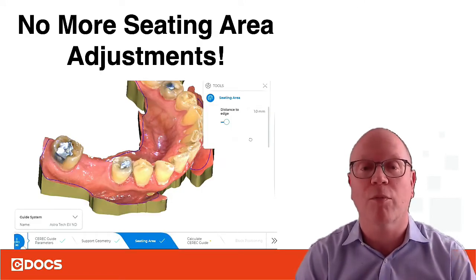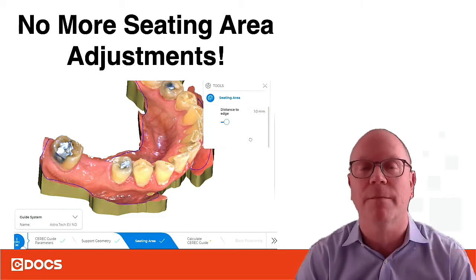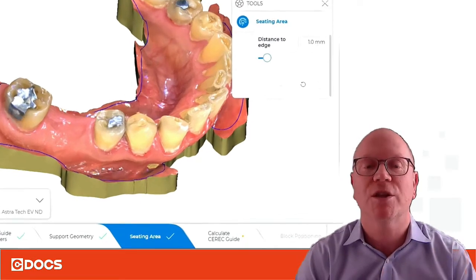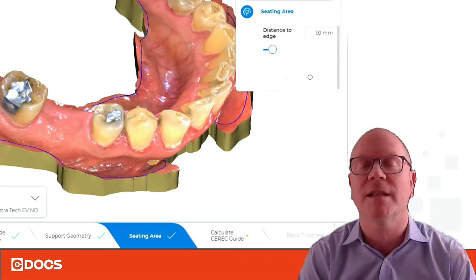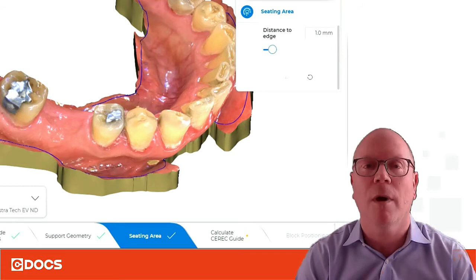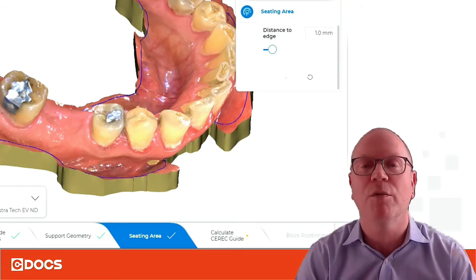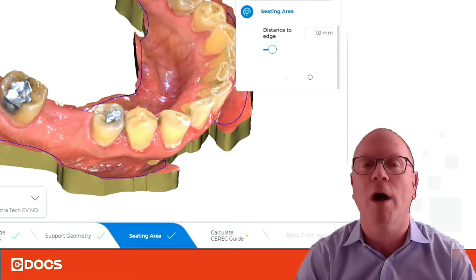The first one that comes up right away, which is a huge help, is no more seating area adjustments. As you take a look on the bottom, you see where it says support geometry and then seating area. What a pain — you had to slide the slider, you had to click to cut those blue lines to where you want it to and then you'd get an initial proposal. But that's all gone now.